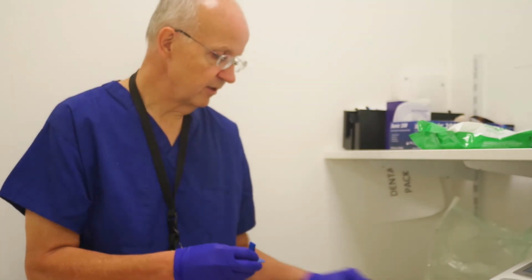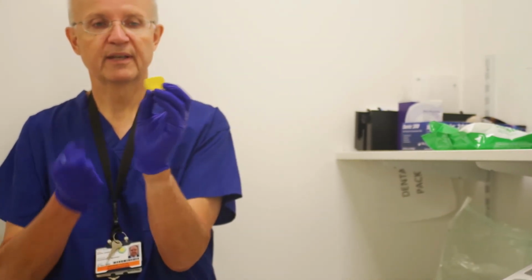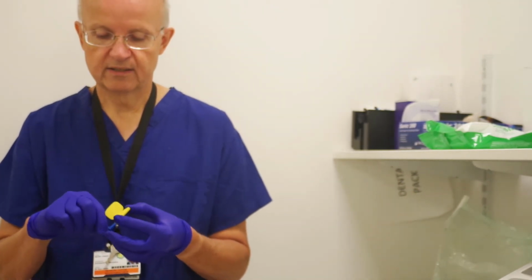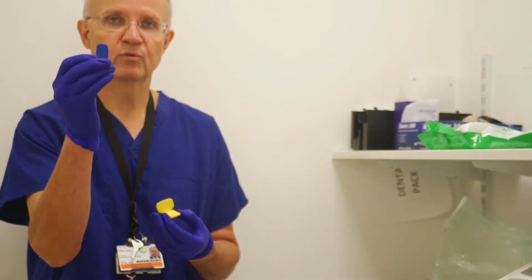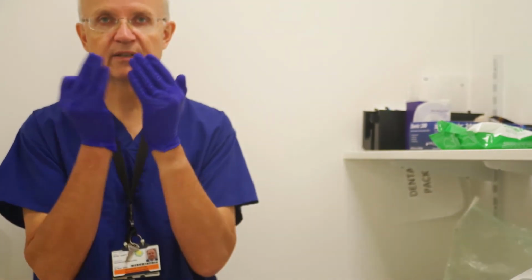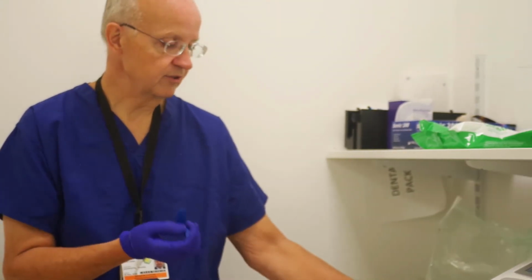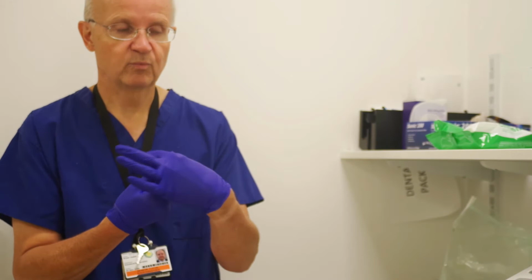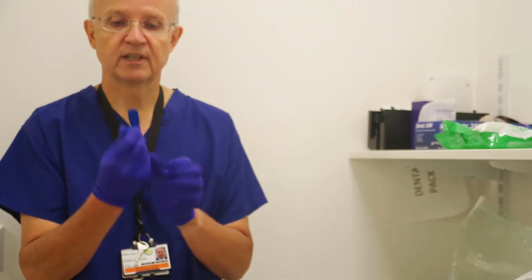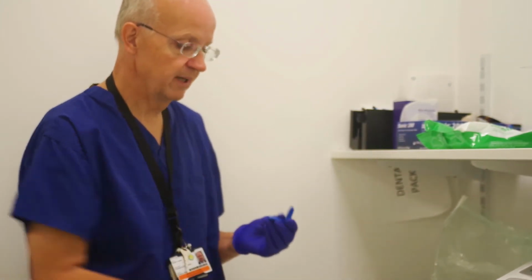So the anterior holder is designed very slightly different from the posterior. You can see the posterior one there, it holds the film in a landscape position, whereas the anterior holder is going to hold the film in a portrait position. And the reason for that, if you think about it, as the teeth come forward around the arch, they get longer and thinner, and so it's much more difficult to actually place the holder in with the film in the landscape. That's going to bend, whereas if you place it in the vertical position, it's going to give you a nice image of the entire tooth from crown to apex.